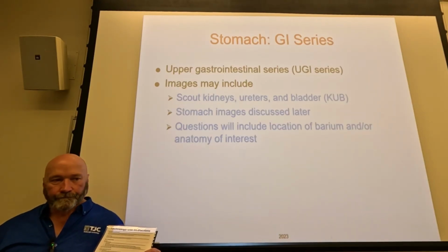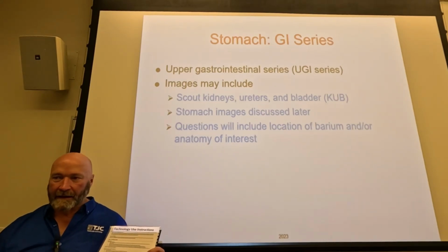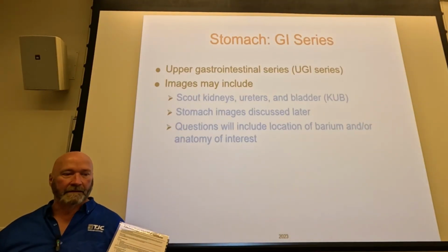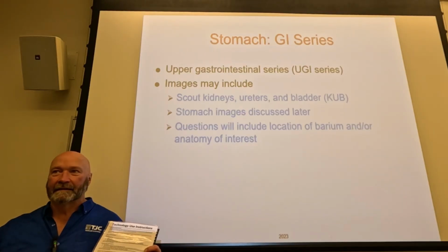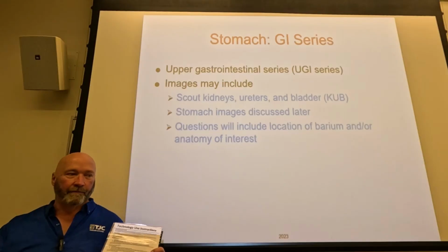So if I lay the patient on the back, just flat on their back, and this really is upper GI in about 5 minutes here. If I lay the patient flat on their back, where's the air going to be? Think about the different portions of the stomach. Okay, let's start with the barium.